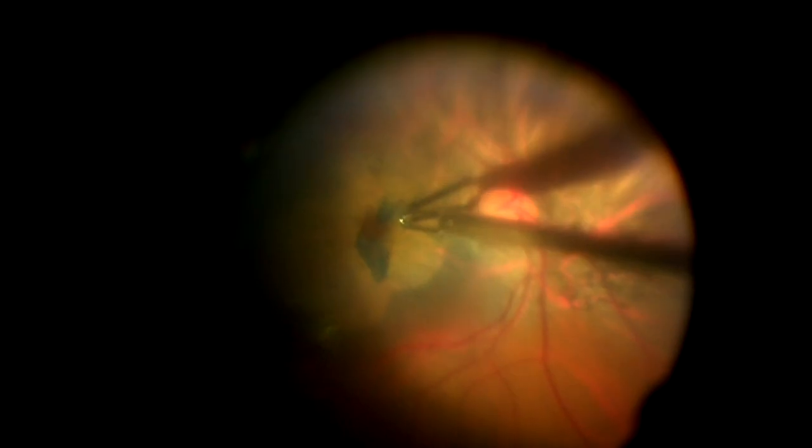So once we finish the flap, you can remove the remaining internal limiting membrane and complete the surgery with an air-fluid exchange.